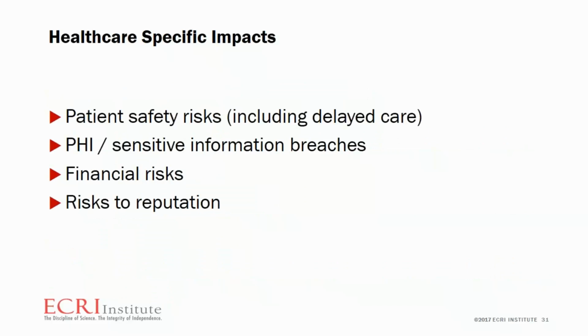Of course, in healthcare, our top concerns are patient safety, including delay of care, PHI and sensitive information breaches, financial risks, and risks to reputation.